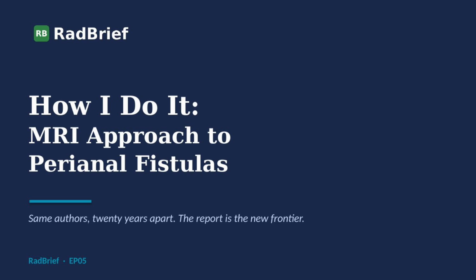Surgeons want two answers from a perianal MRI. What is the relationship between the fistula and the sphincter, and are there any extensions that will recur? That is it. Most reports do not lead with that. The new How I Do It paper is trying to fix it.